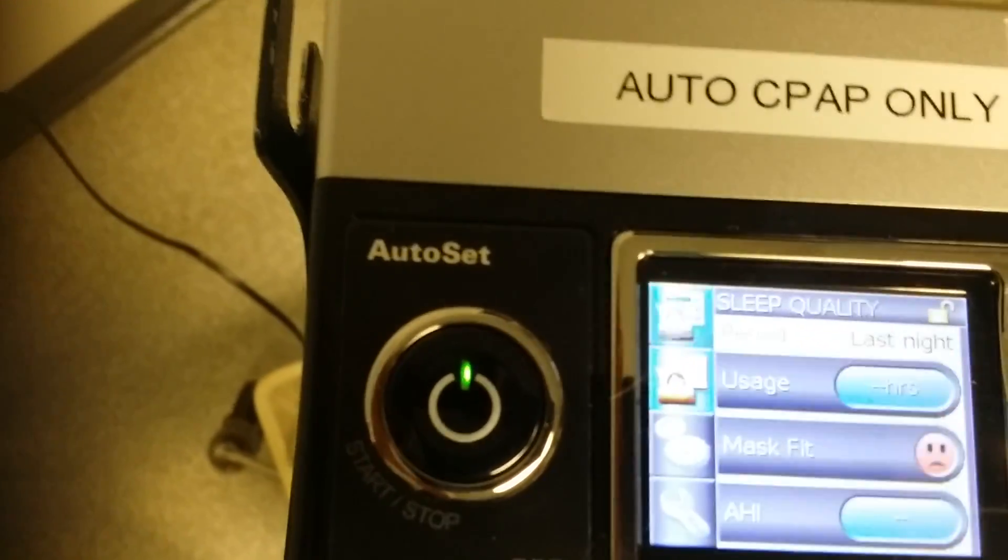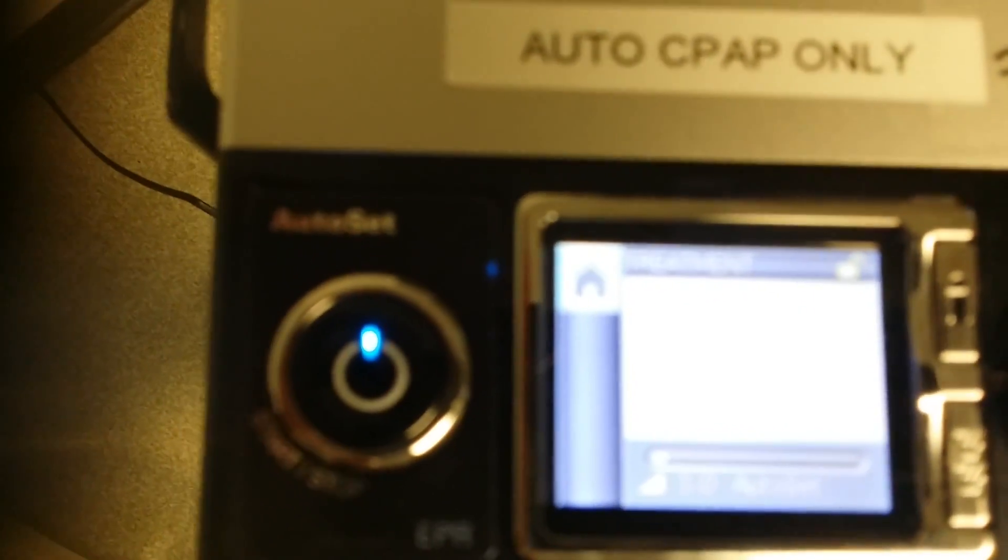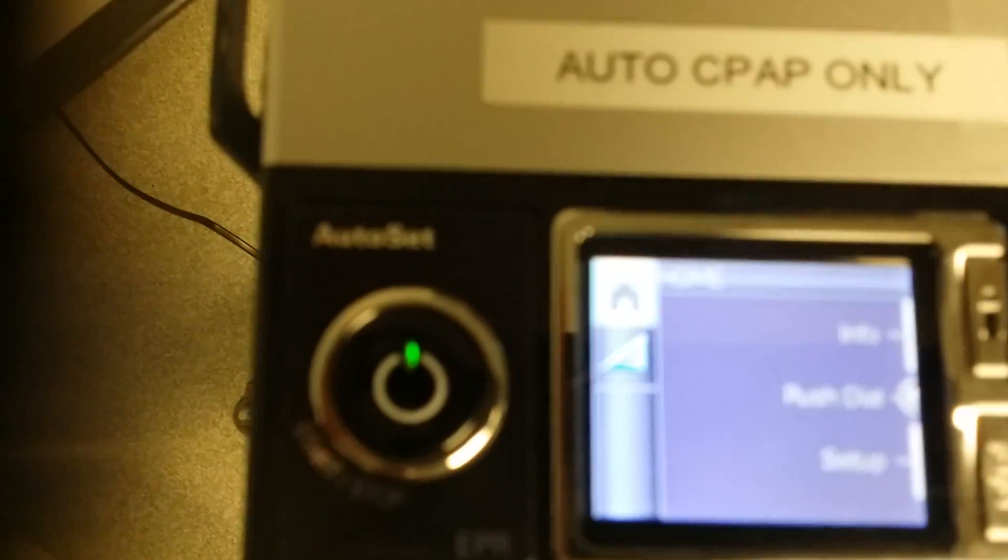You've got a mask fit and all the things that you would do to set the mask up correctly. You could have done this in the beginning to make sure the mask doesn't leak. To get out, just hit the power button once, then hit the power button again to turn it off.